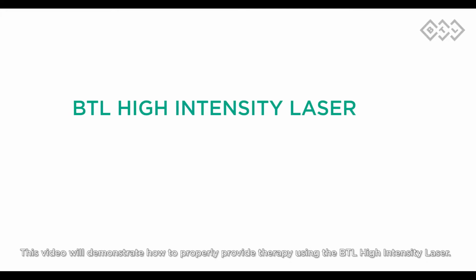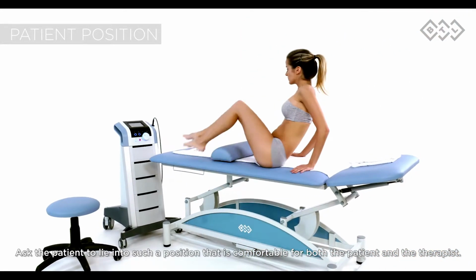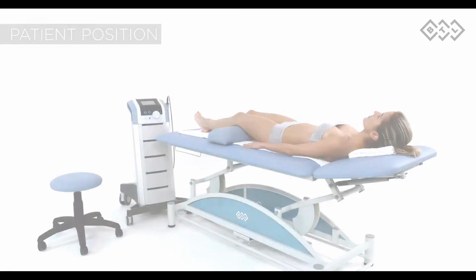This video will demonstrate how to properly provide therapy using the BTL high-intensity laser. Ask the patient to lie in such a position that is comfortable for both the patient and the therapist. The therapist should be able to reach the affected area easily.